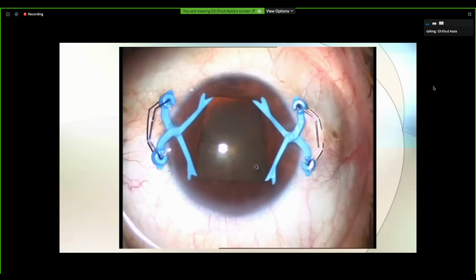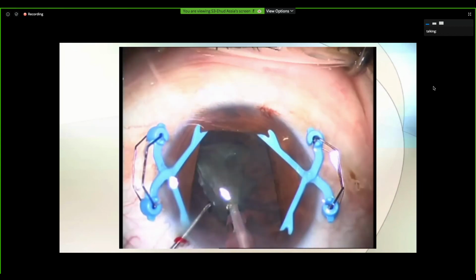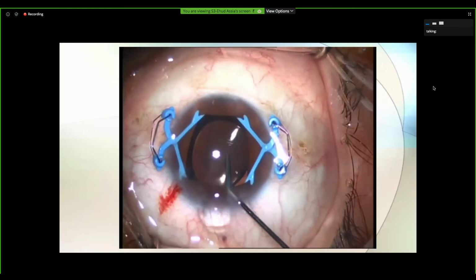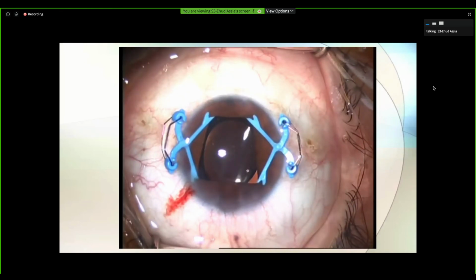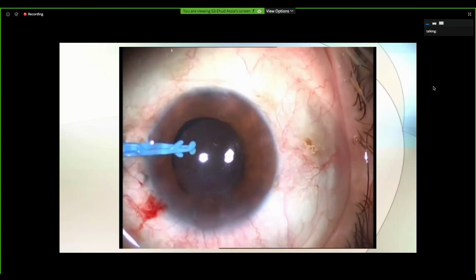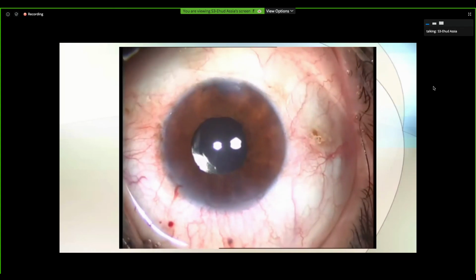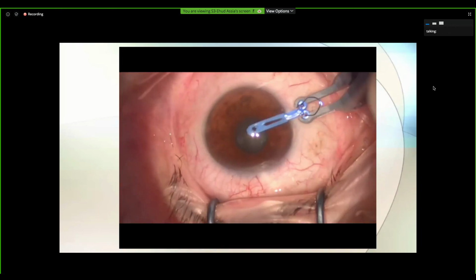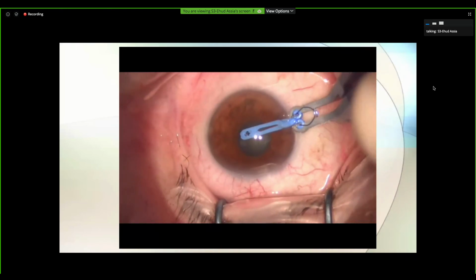We also place them a little bit skewed so that it creates kind of a trapezoidal shape opening so that the wider base is facing the surgeon, so there is more space for the instruments. Pulling it out simply by using the same designated forceps, close and pull out, and the pupil regains its normal shape. And this is the other technique, going from the outside in.